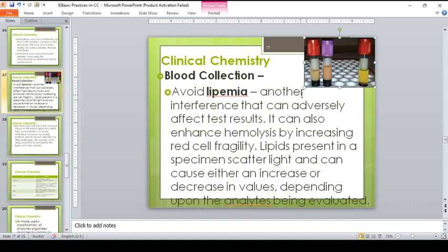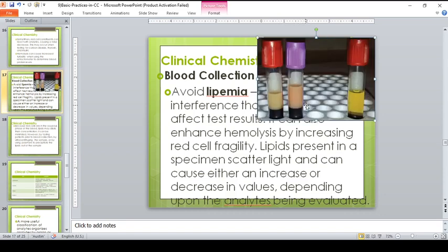Okay, so how does it differ from hemolysis in terms of physical appearance? In hemolysis, guys, what you see is plasma or serum that has a reddish color, or red pinch in color. May pagka-reddish siya or pinkish. That is for hemolysis. In lipemia naman, it looks whitish or milky in color. So these samples are lipemic, so the serum is lipemic. And this is a normal serum, okay?